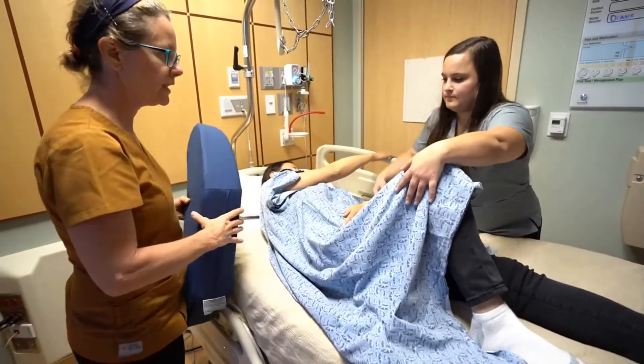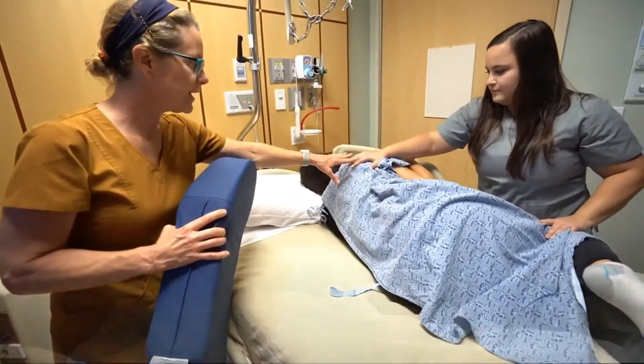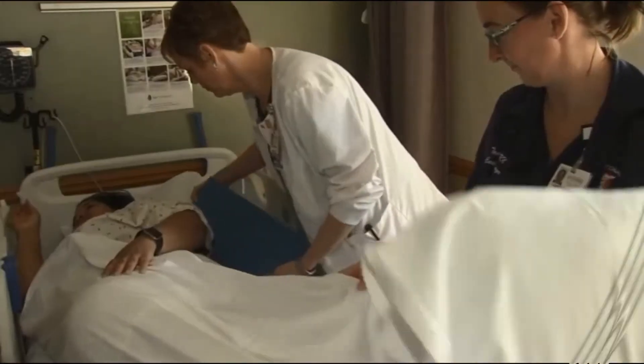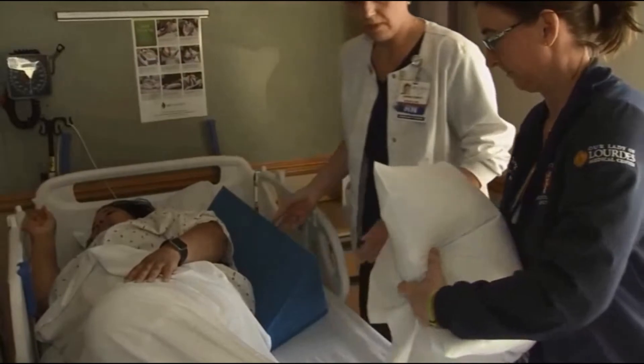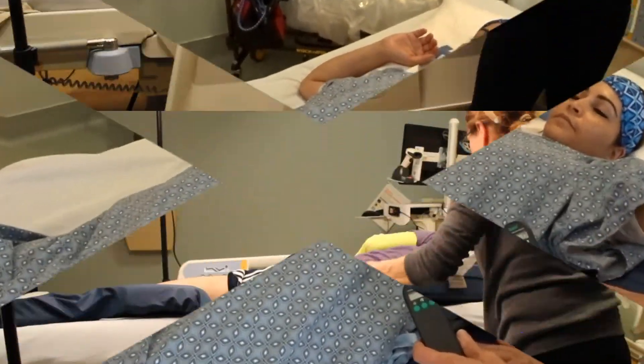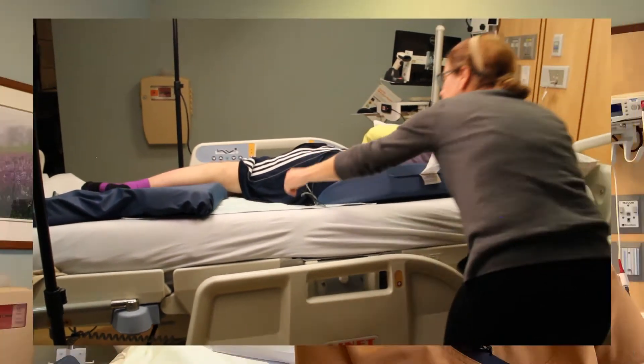To stop bedsores that occur in the lower sacrum and coccyx area, nurses have always turned and repositioned a person and supported them at about 30 degrees lateral to the side. Yet amazingly, no one has ever asked what is the best way to support a person so that they could stay in this pressure-reduced, offloaded position comfortably and stably. I would order an assist with turning only to come back a little while later and find my patients back on their bedsore or in some awkward, weird position that clearly wasn't helping.